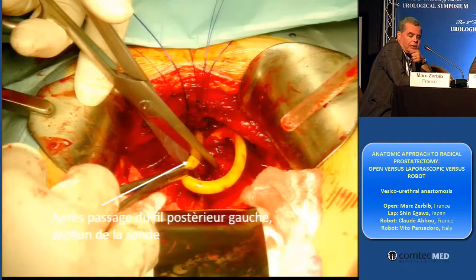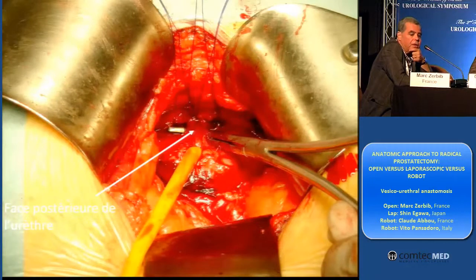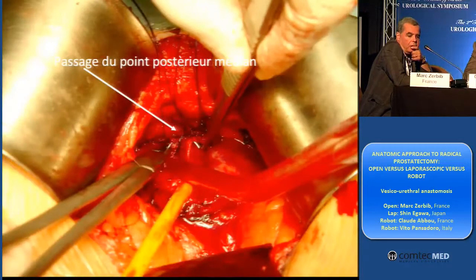I cut the catheter. And this is the posterior wall of the urethra. And I put my stitches immediately — three stitches — using a double needle also.